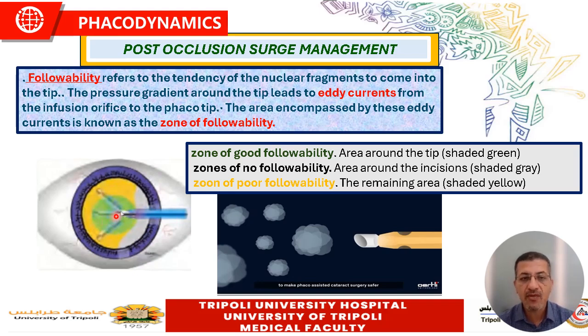Now, this followability is very important, especially in cortex removal and in fragment emulsification, so that the fragment is following the phaco tip rather than the phaco tip following the fragments. You can see in this animation the meaning of the eddy currents.